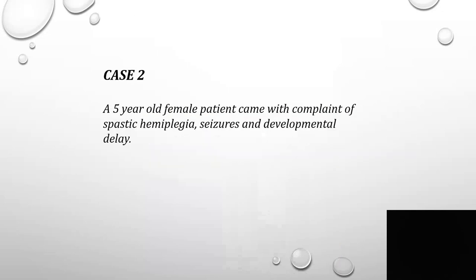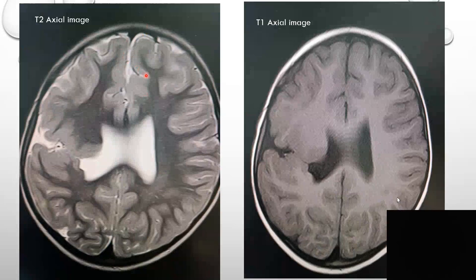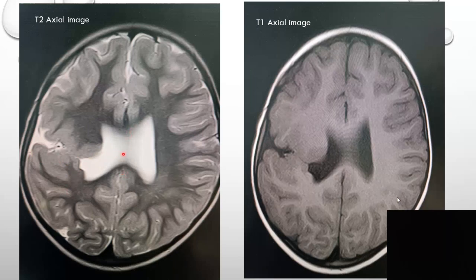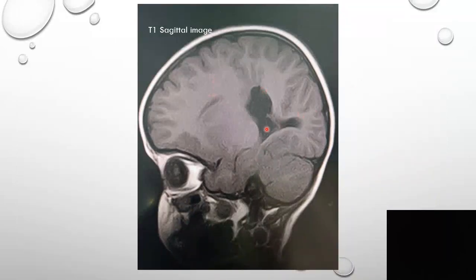Case number 2: A 5-year-old female patient presented with complaints of spastic hemiplegia, seizures, and developmental delay. The T1 and T2 axial MRI images show evidence of a cleft following CSF intensity with a focal pointed nipple-like outpouching extending from the ependyma of the body of the right lateral ventricle up to the pial cortical surface of the right parietal lobe. The lips of the cleft are closely opposed with dysplastic heterotopic gray matter lining the cleft on either side. There is absence of septum pellucidum; however, the corpus callosum appears normal. This is the characteristic appearance of closed lip unilateral schizencephaly.